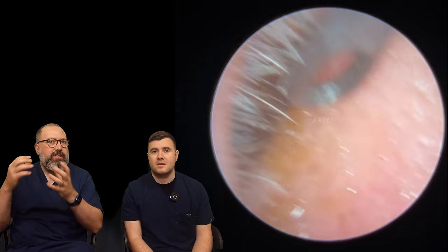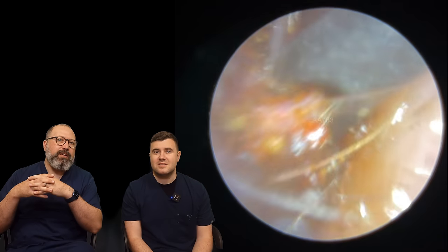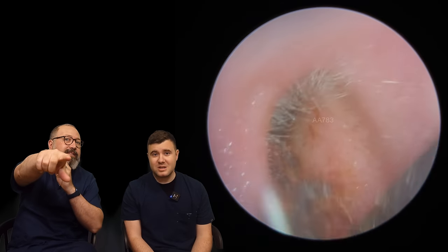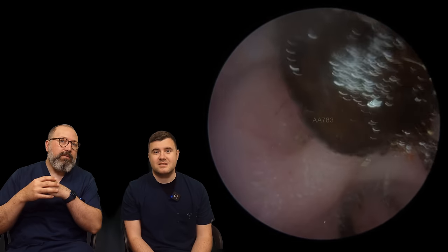The olive oil will help to slide it out a little bit easier. When you get that little bit of movement it just starts to come away a little bit easier. We're just getting the Jobson Horne behind this — almost crashed into the camera there, we've got to work really close to it to get a visual just beyond it. It's getting a good viewing of the Jobson Horne now. St. Bart's Hook has come out a couple of times as well — we don't normally see that one come out too often. But it's coming away really well — there we go, look at that plug! That was actually quite long, so no wonder it wasn't going to come out easily.